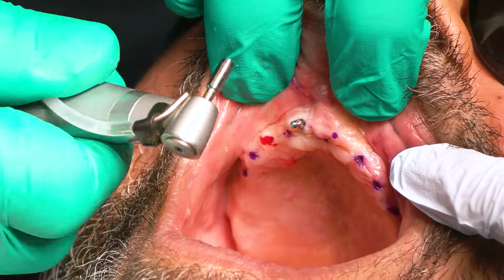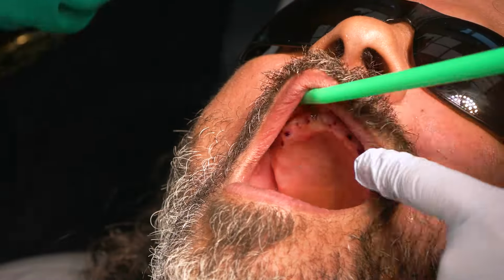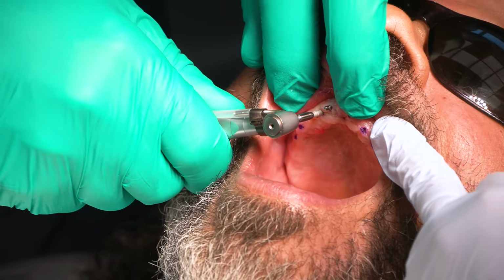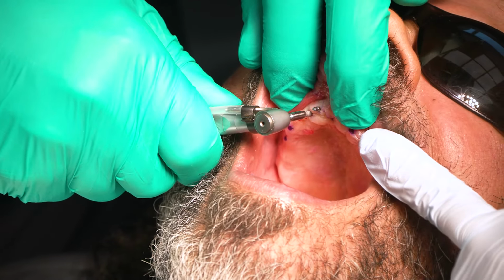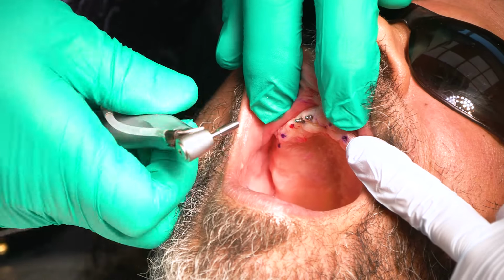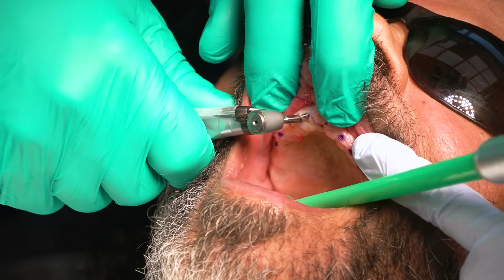Of course, we like that sound. That's a good sound. Next one. First implant's in, Robert. You're doing great. So that sound means we've reached 30 newton centimeters of torque, which is the minimal amount of torque you want to load these mini implants immediately. Next implant.